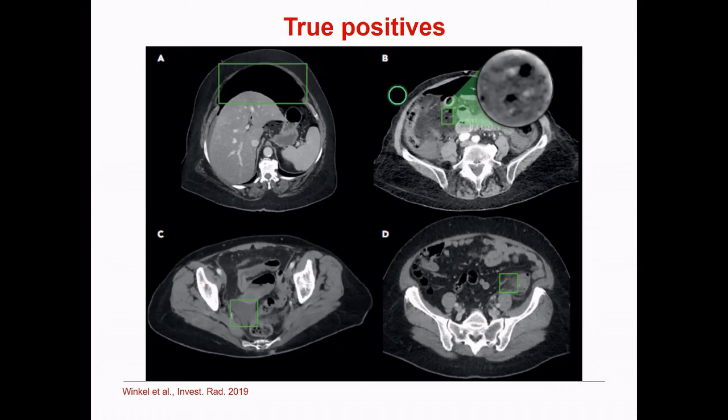And here you can see very small pockets. They're also black, so they mean this is air, and they are closely connected to the release of air from the bowel. I'm sorry, this is free fluid, and this is some fat reaction. And all these green boxes were not placed by us, but by the algorithm. And we can still say this is right or wrong.